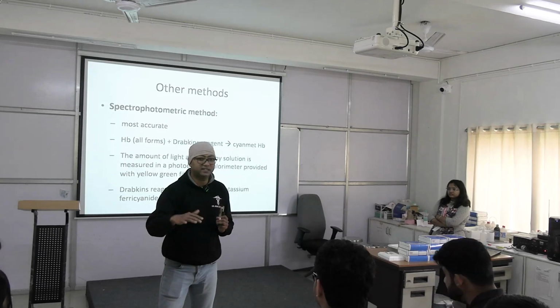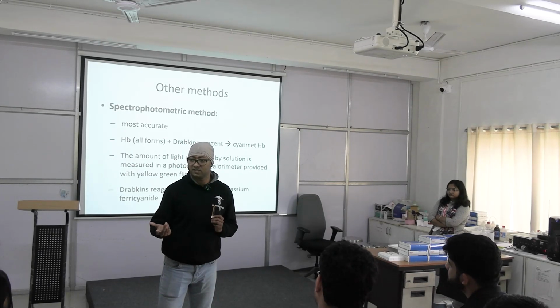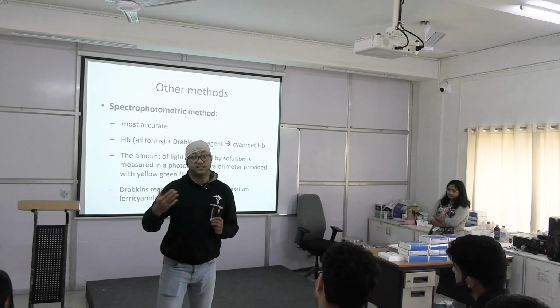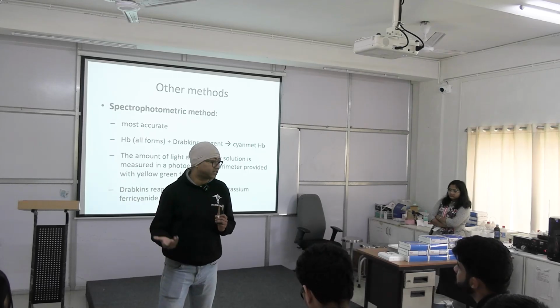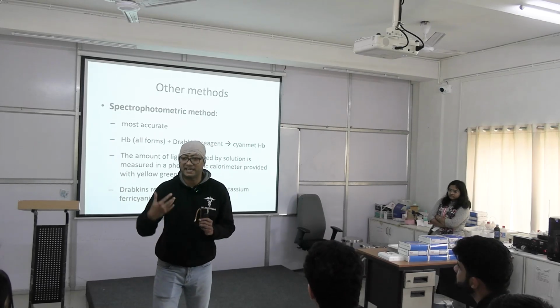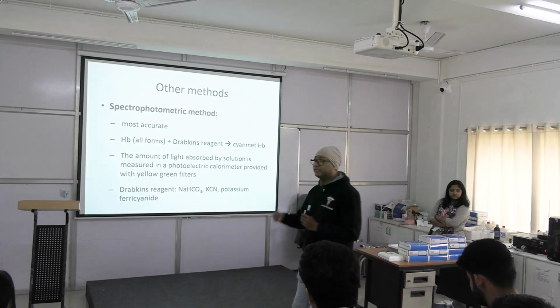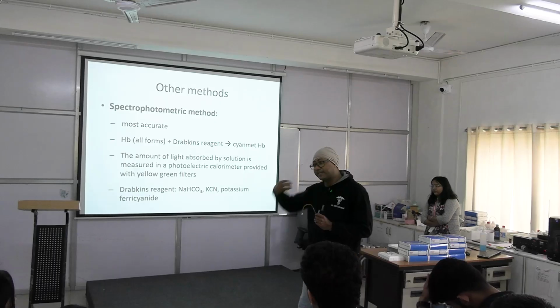आपको बस पता करना है 13 या 14 या 15 या 9 और 10 और 6 और 7, ठीक है? So then we apply Sahli's method because एक दिन में हमें 5,000, 10,000 hemoglobin estimation करना है. Then we will follow Sahli's method, ठीक है? Clear? So here is the importance of Sahli's method for community purpose, for mass screening purpose.